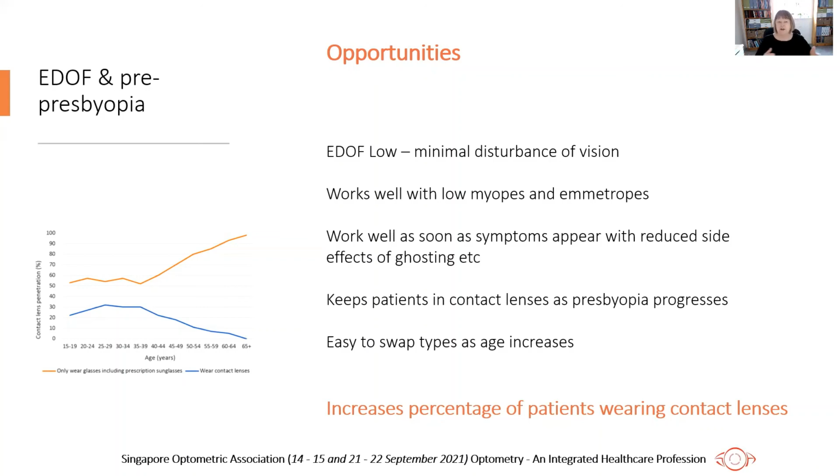Once you've got the patient over that psychological barrier of getting older, and let's face it, we all do that, when you hit that age where you start to need reading glasses, it's a horrible shock and reminder you are actually aging. Psychologically, you don't even have to tell the patient it's a presbyopic correction because it's just superior optics. Once they're wearing them, you've got them used to using their contact lenses to be able to see, and going back to glasses or spectacles is a more uncomfortable visual environment.